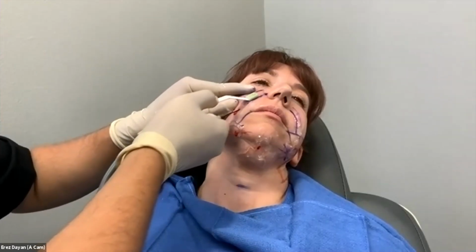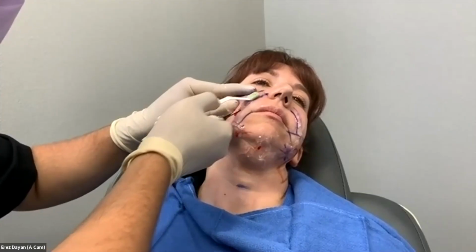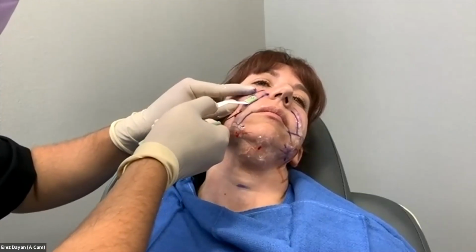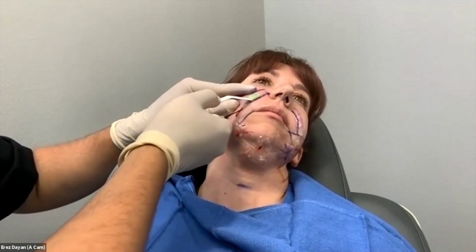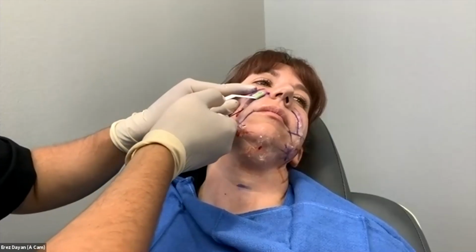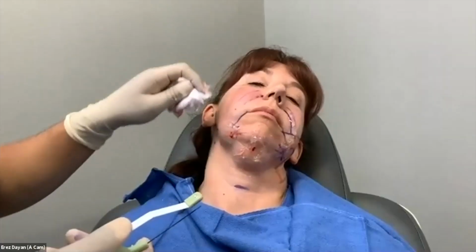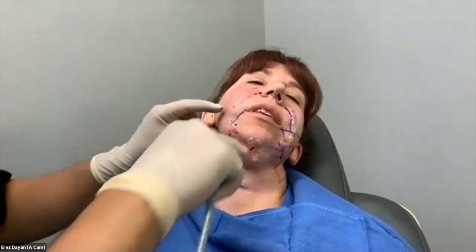I prefer this over filler. Now that I'm at external temperature, the device is only firing to maintain that temperature. It's not firing constantly. So that's it. Kind of feels good. Does it feel good? It's like a warm massage. I'm going to do side by side, so let me just do the gel here.